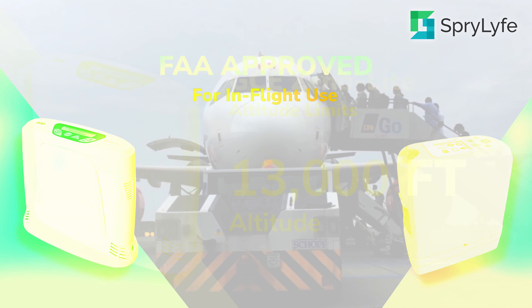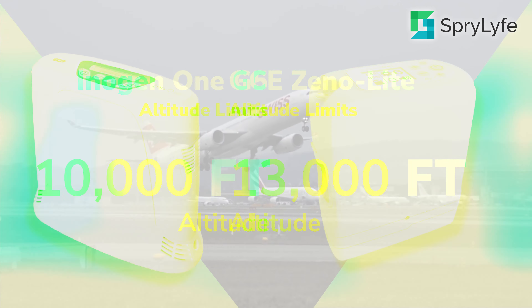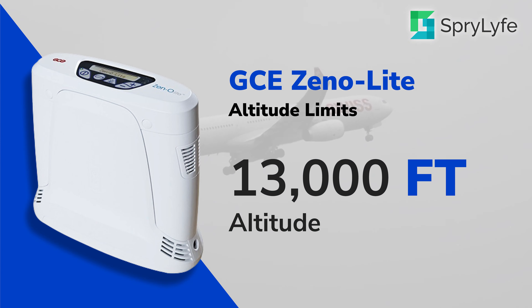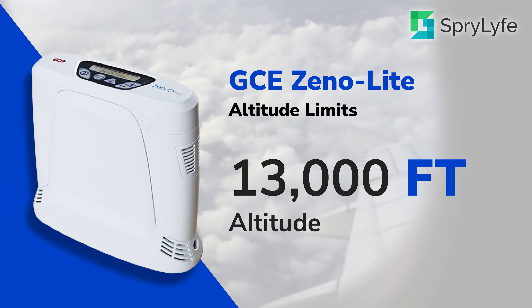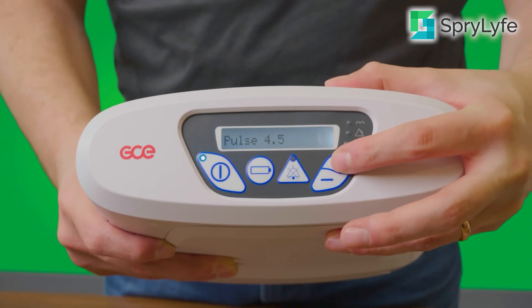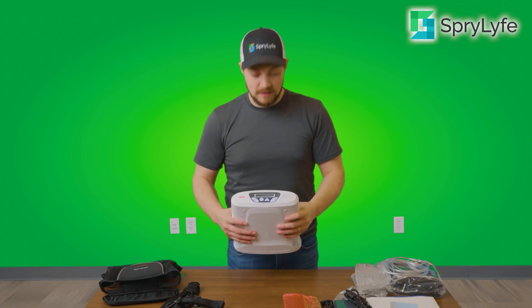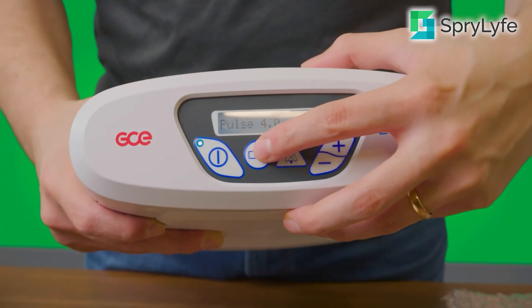The Xenolite goes up to 13,000 feet in elevation compared to the G5 at only 10,000 feet. So the GCE Xenolite is a little bit more versatile for international travel, going to high altitudes, and things of that nature. The Xenolite also offers half settings compared to the G5, which only offers full settings. This way the GCE Xenolite will be able to dial in whenever you are going on a setting of 2.5 or 3.5 — you will specifically be able to put the machine on that level.